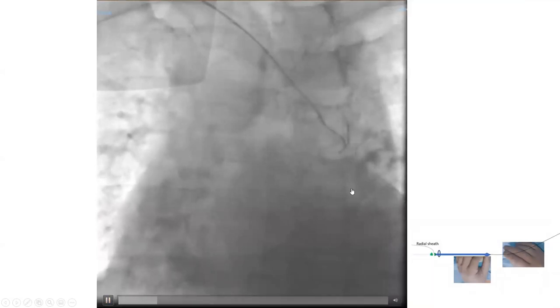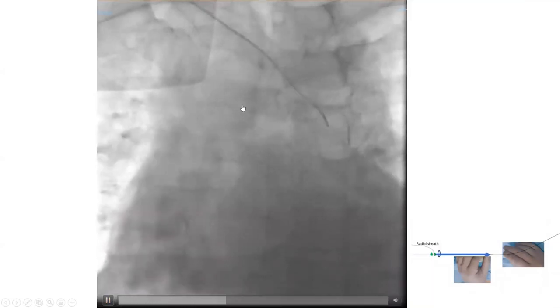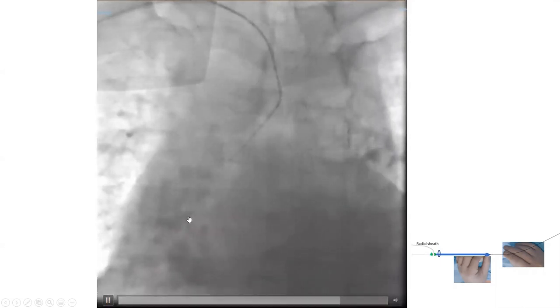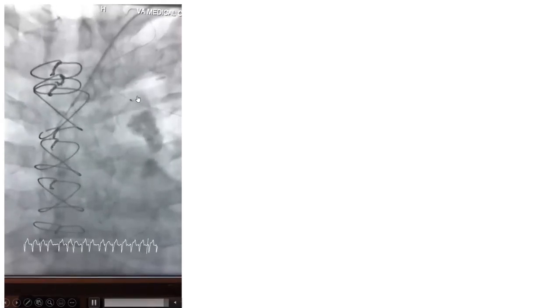Here's another case illustration to embed this in your brain. From the descending, we pull the catheter with a counter-clock and it will jump — you'll see it in the ascending aorta. Then we advance the wire. This is another case coming from the left radial — we fell on the descending aorta and pulled from descending, flipping the catheter to the ascending. Notice in none of those did I use deep breath — it's just catheter torquing, although you can use deep breath, but torquing is more successful and more important to remember.